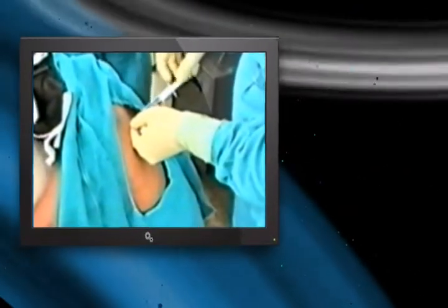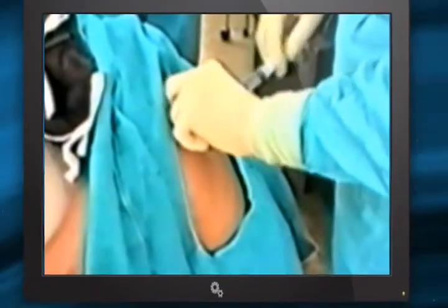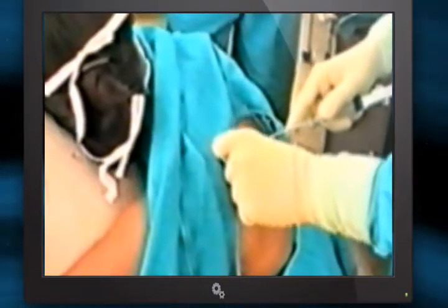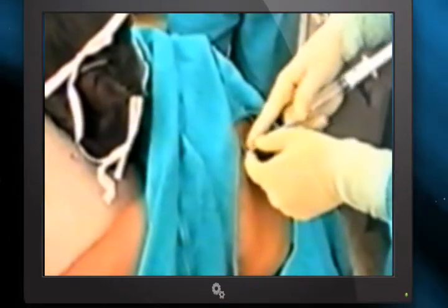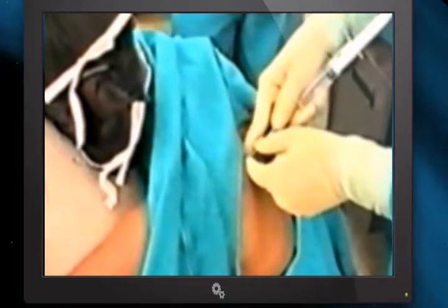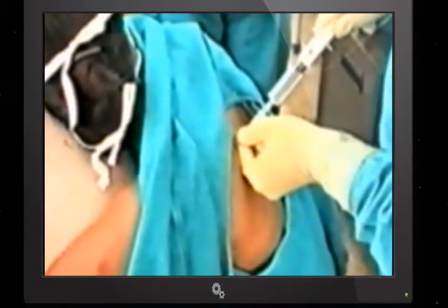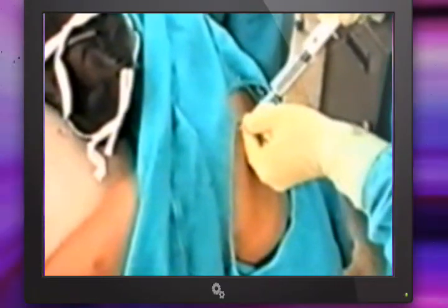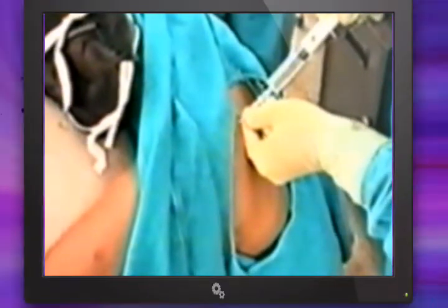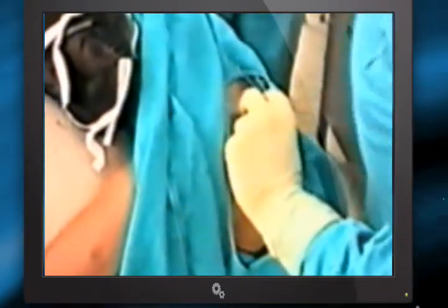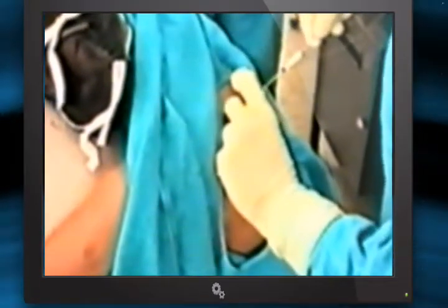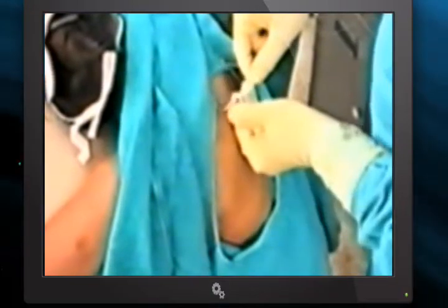In this patient, local anesthesia is given after aseptic precautions and the procedure is carried out. A syringe with 10 ml normal saline and gelco cannula is inserted at the site of lesion, and the needle is pushed inside while pulling the syringe to look for a gush of air. The moment the gush of air is seen, you stop, take out the syringe, and then insert the laser fiber.